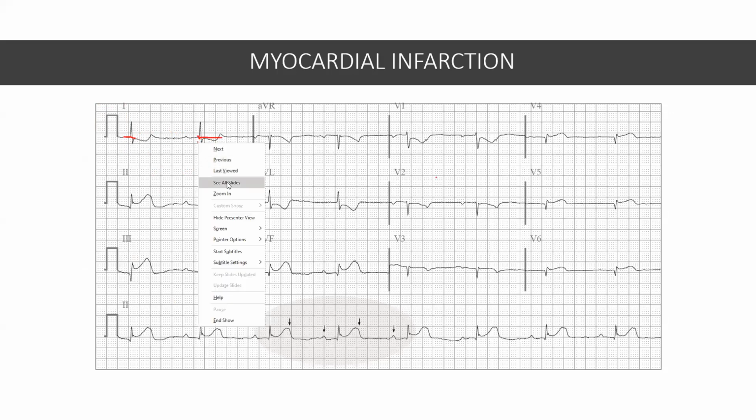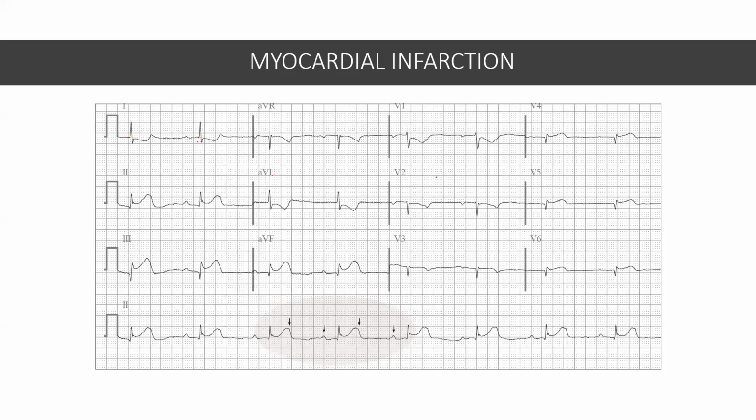Is the ST segment normal, elevated, or depressed? It's depressed, so we're going to label it D as depressed.